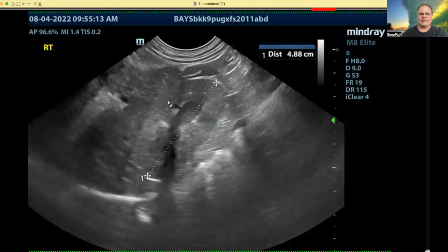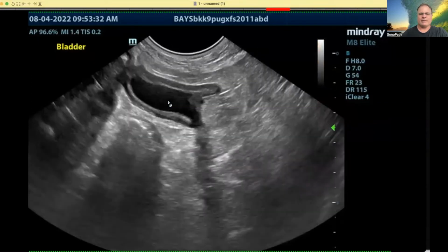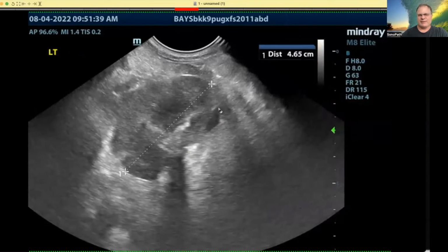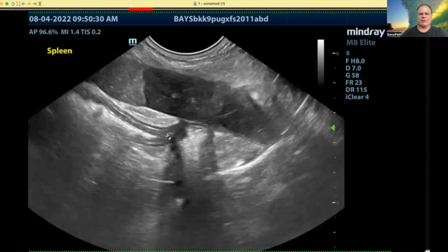Some older kidney, no big deal. Some pyelectasia in this kidney, but look at this kidney here. We have a little outpocketing or hypoechoic nodular changes, and there's another one over here which we'll see a little bit better. And we have reactive fat around this kidney. We'll see it better in video. Again, always interpret through video and not still images. Still images can really mess with you as far as creating pathology that isn't there.